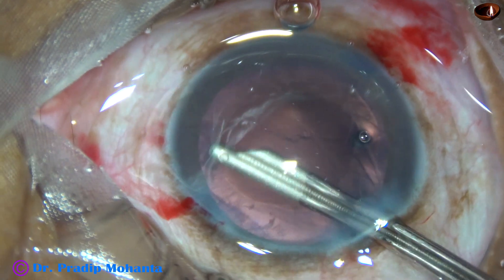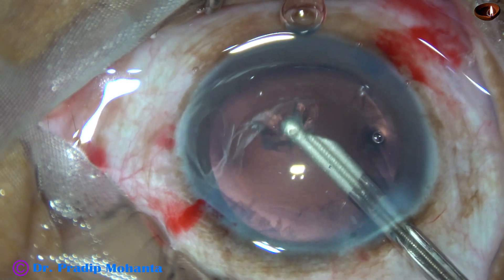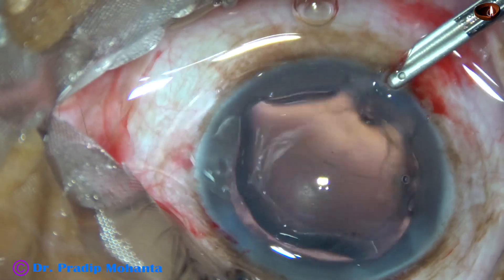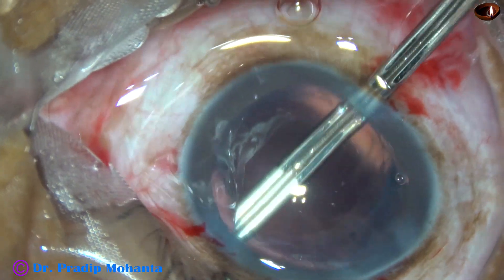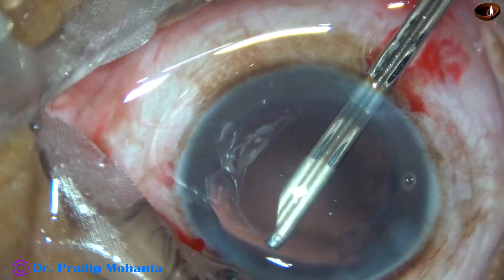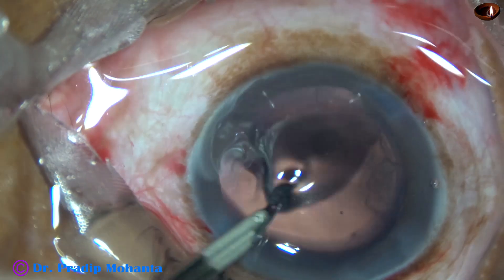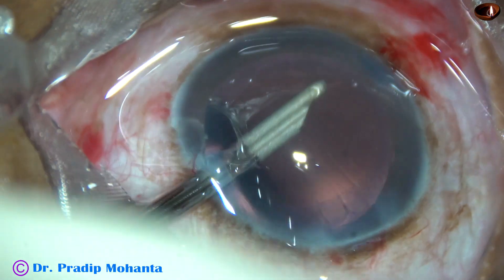Now this is aspiration of cortex. At this time, the irrigation and aspiration is getting balanced, so there is not much fluid layer over the cornea. But if we use bi-manual irrigation and aspiration, it is difficult to maintain this balance — irrigation may be more and aspiration may be less, so the fluid layer over the cornea will remain.